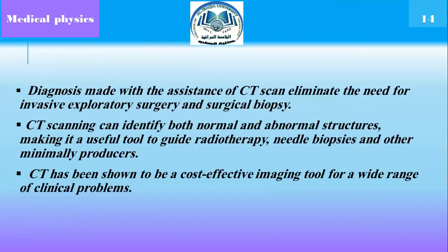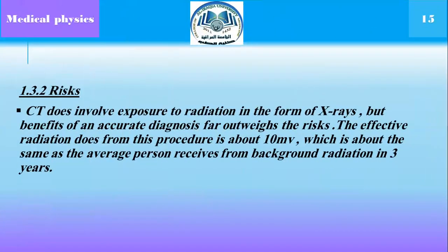CT scanning can identify both normal and abnormal structures, making it a useful tool to guide radiotherapy, needle biopsies, and other minimally invasive procedures. CT scan has been shown to be a cost-effective imaging tool for a wide range of clinical problems. All this is the benefit of CT scan, and now we will explain the risks of CT scan.